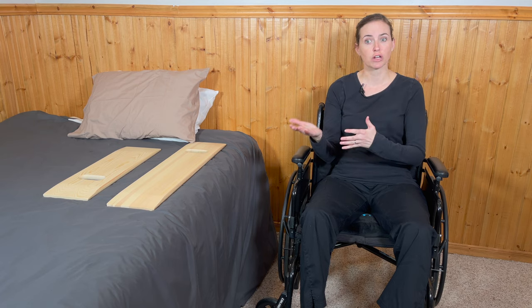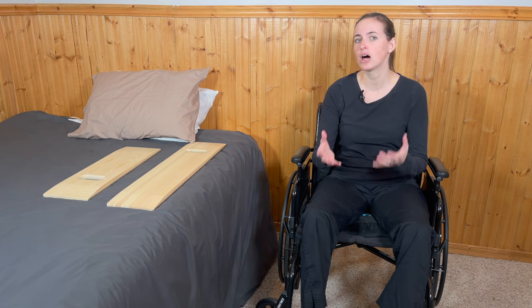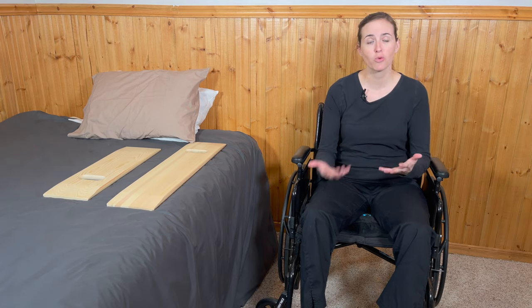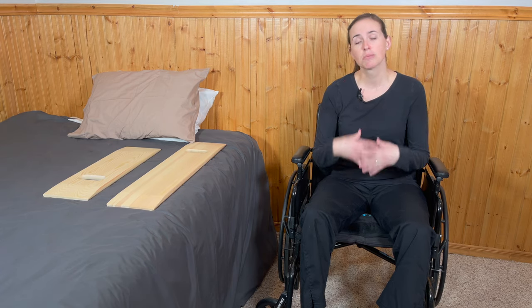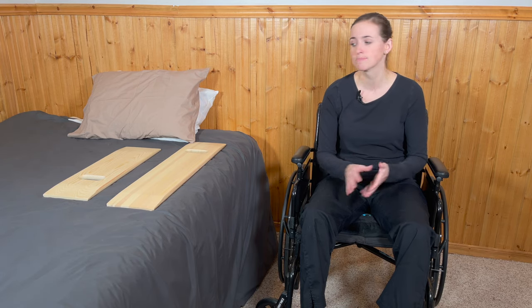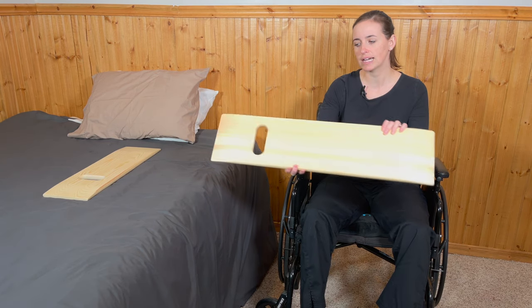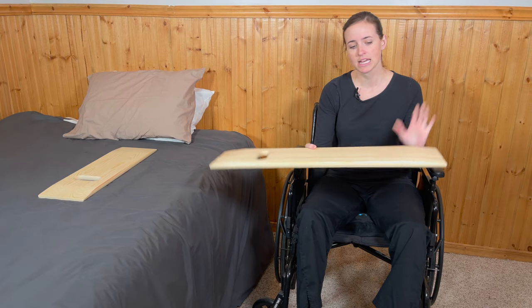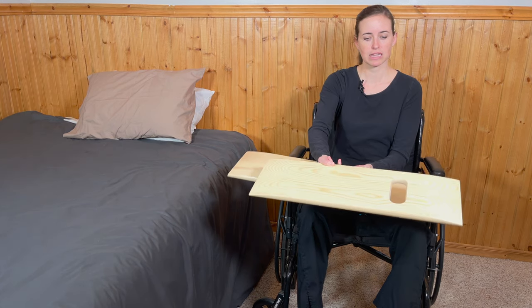Oftentimes if you're doing a slideboard transfer, you're not alone — you might have a caregiver or family member helping you during recovery. In this situation I'm going to demonstrate it independently, but I'll talk through how a caregiver would be involved. Here are the two slideboards I have today. They're the same style with a 440-pound weight capacity — one is a longer version and one is shorter, so you can see the length difference.